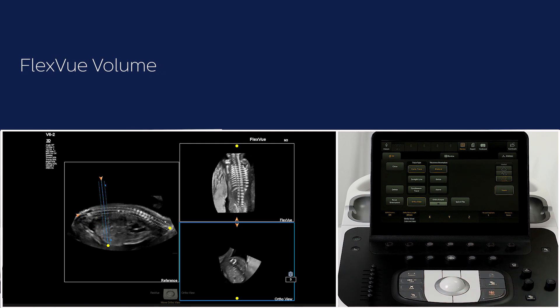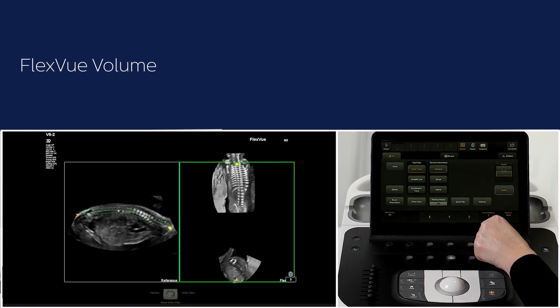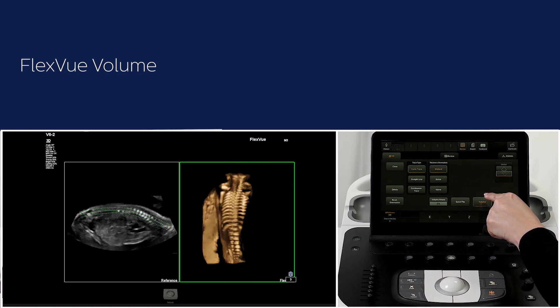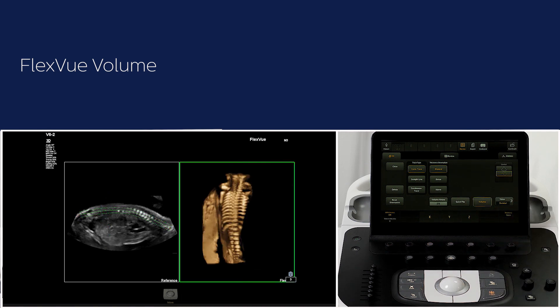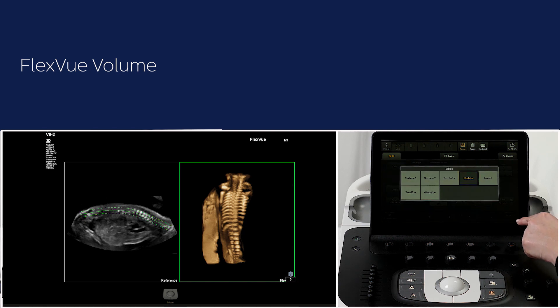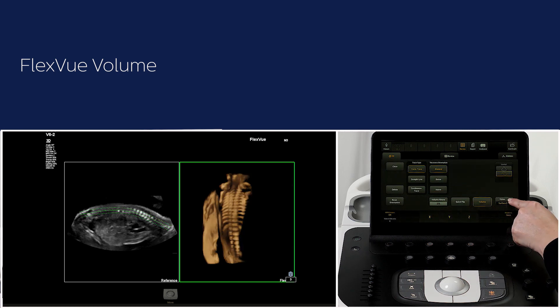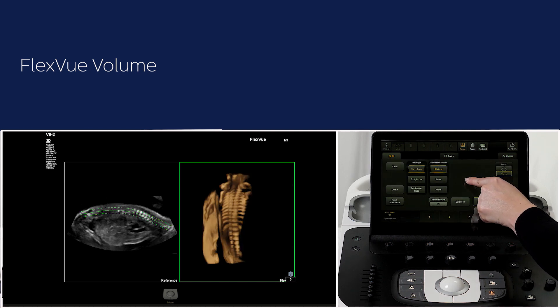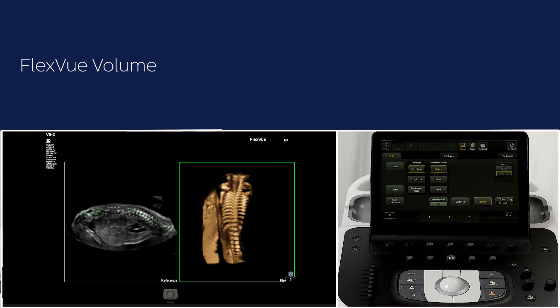Another feature is FlexView volume. Deselect ortho view and press volume on the touchscreen. FlexView volume adds the option of obtaining a 3D image in true view or glass view rendering or any other vision setting, in addition to the 2D reference image, and it offers another perspective for diagnosis. All the visions work in FlexView volume: surface 1, surface 2, dynamic color, skeletal, invert, true view, and glass view.